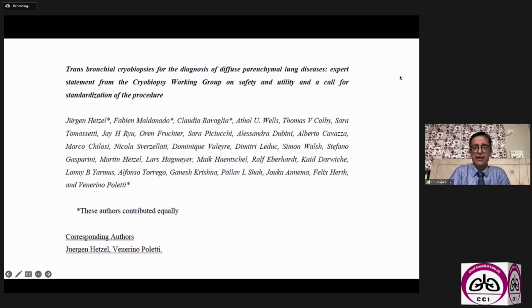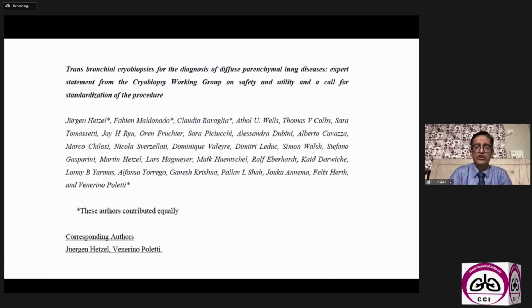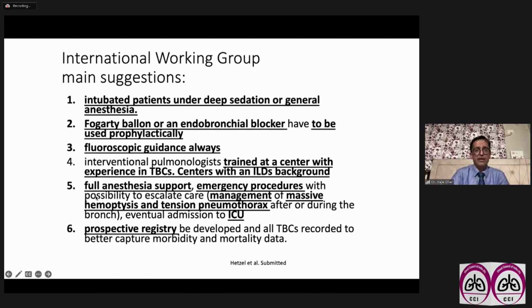This is a very recent paper, well, recent as in 4 years old, which looks at transbronchial cryobiopsies for the diagnosis of diffuse parenchymal lung disease. And I will show you a couple of suggestions from the international working group. So we talked about deep sedation or general anesthesia. We talked about the Fogarty balloon or the endobronchial blocker. Fluoroscopic guidance always, you see, is what's been said in this particular guideline.